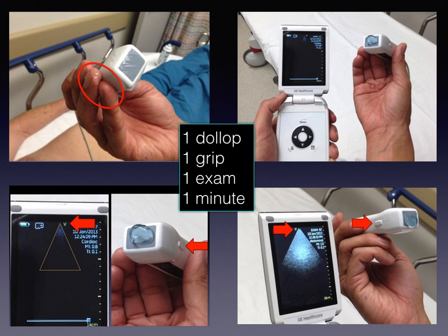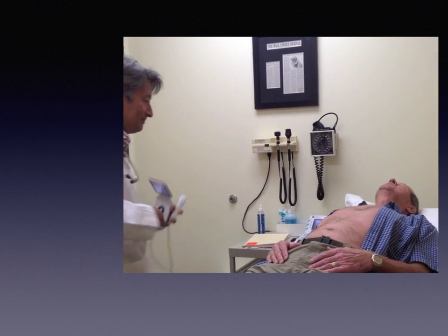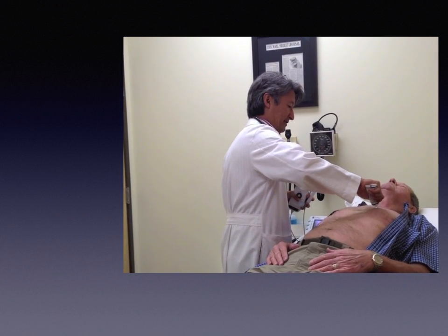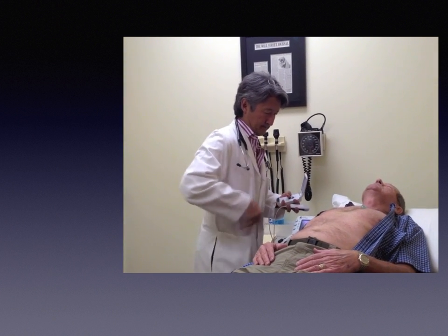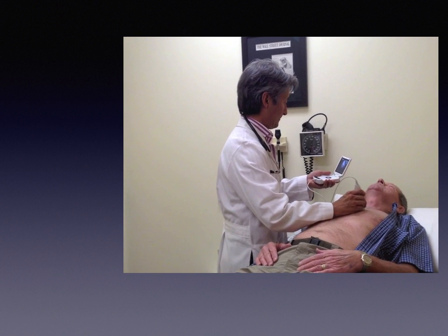Remember, we're going to use one dollop of gel, one grip, and do one exam over and over again. That takes 1 minute. So let's get started and start the time for our first view, the parasternal long axis. Men need only unbutton their shirt. Women can keep their bra on, which saves them time. There's that single dollop of gel. Then place the gel in your pocket so you don't lose it. And then get your parasternal long axis.